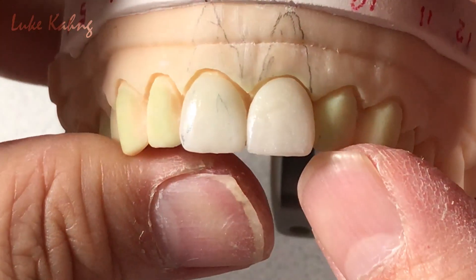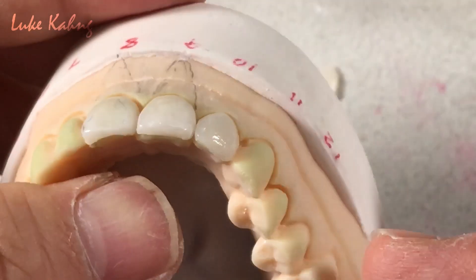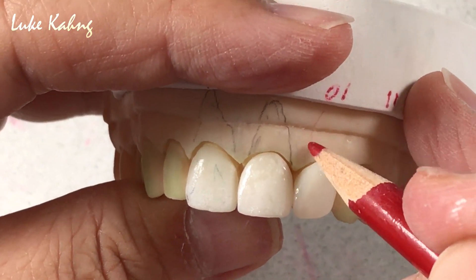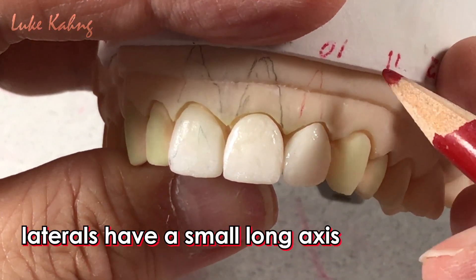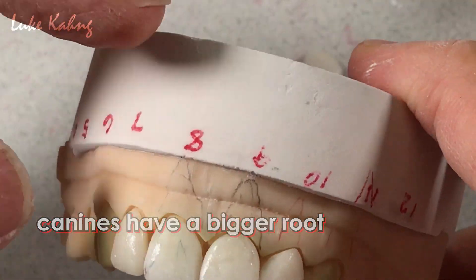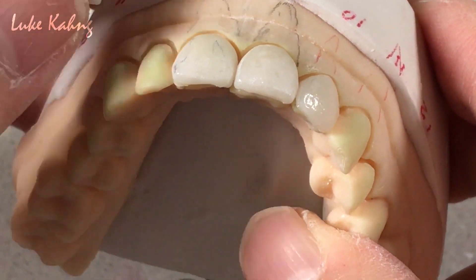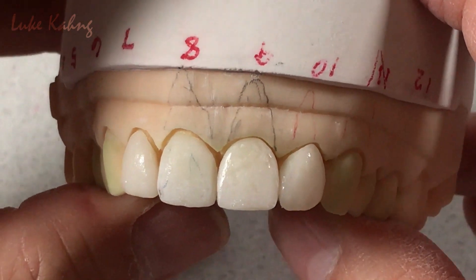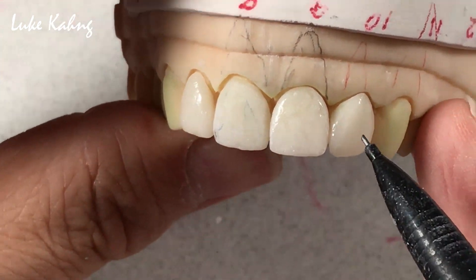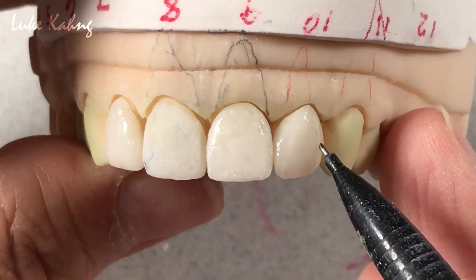So once I set up the two units, I move to the lateral. Lateral has kind of the same alignment, but you have to make sure the other side. Lateral has a small long axis, like this. Canine has bigger roots. I try with another lateral — I want to make the same golden proportion if I can. The limitation is two: the shape and contour is different. So I have to concentrate on the bigger one. I like the golden proportion — for example, it's 100%, 70%, and 80%. So I grind a little bit here and make this one a little bit flatter.